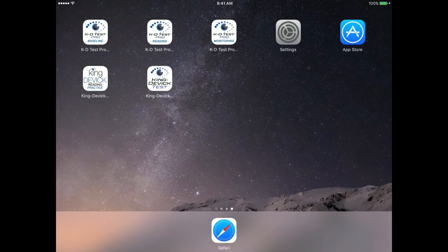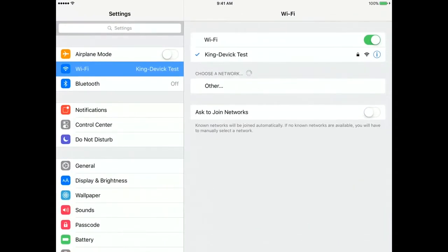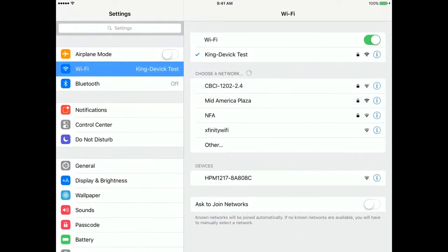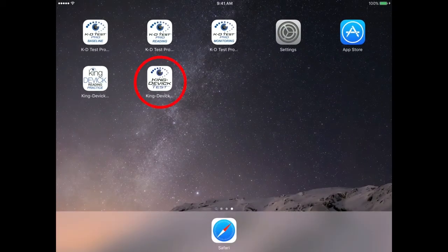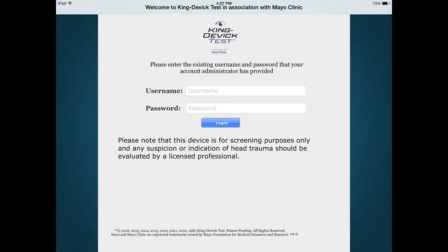Be sure you're connected to the internet when logging in for the first time. To do this, access the settings icon, tap Wi-Fi on the left, and be sure your Wi-Fi is turned on, indicated by the green. To launch the KD test app, tap the app's icon from your home screen. Log into the app with your KDTOS account username and password.